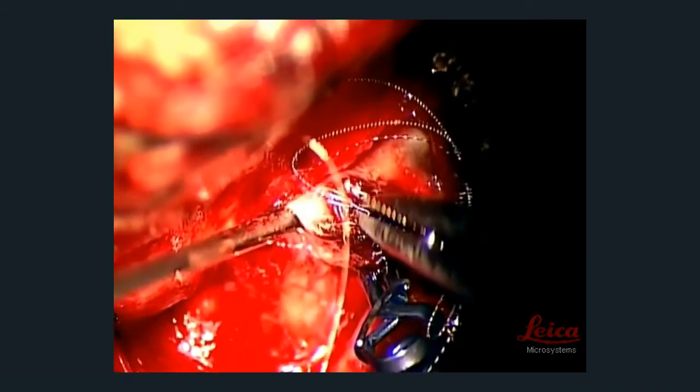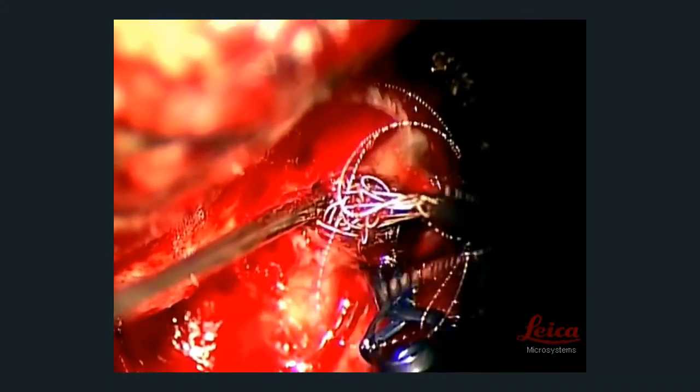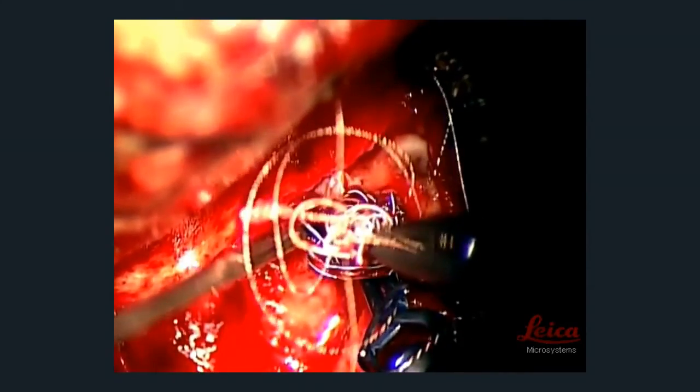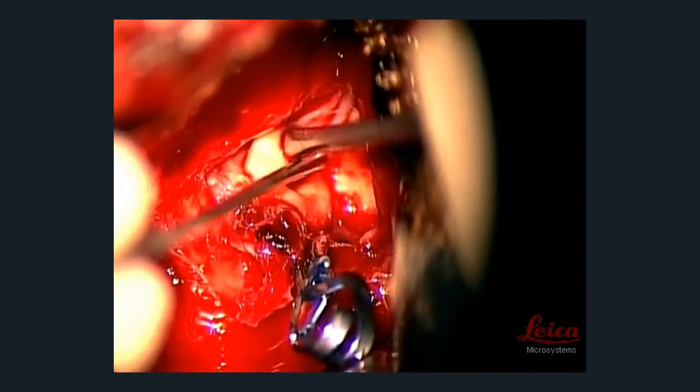I just wanted to put this in here so you could see, you've seen what the coils look like going in, and this is what the coils look like coming out. They're just this strand, almost like a spring loaded into the inside of the aneurysm. Because this mass of coils was in there, it was impossible for us to get a clip across there to seal it off. So the only alternative was to take out all of these coils, to empty out the inside of the aneurysm, and then definitively clip off the aneurysm.